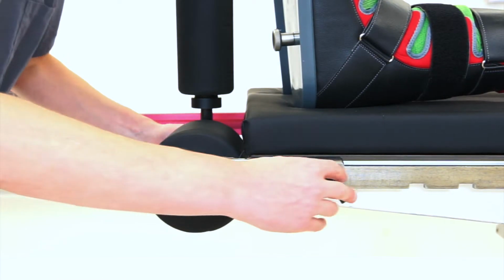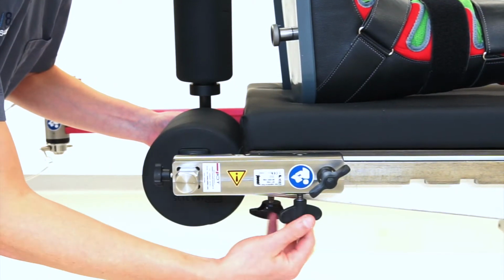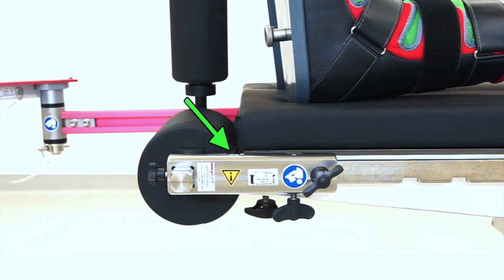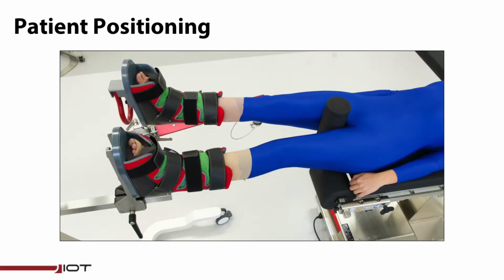After adjusting the femoral support, tighten both wing nuts to secure the POP to the OR table. There are a few threaded holes so the wing nuts can be moved around as needed. Notice the feet are shoulder width apart, the pelvis is straight, and both legs are positioned similarly. This is the goal when positioning the patient.